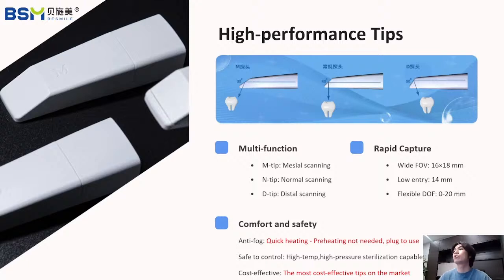For example, if you are doing orthodontic scanning, you can use these D tips to scan the like number 7 teeth. I think it would be very convenient if you use these D tips to scan those teeth.